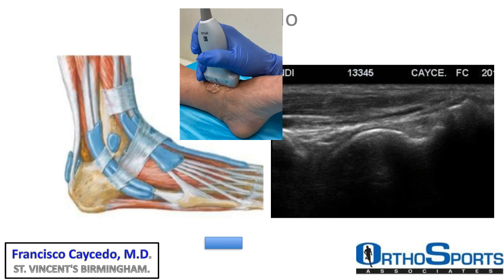So going back a little bit to the anatomy, so we know the principles. The white, that means hyperechoic, is the bone. The black is the cartilage. You can see a very beautiful line. That's the cartilage. How do we differentiate it from fluid? You can see the fluid is more irregular, and the pressure you put on the probe will help us make the differentiation.